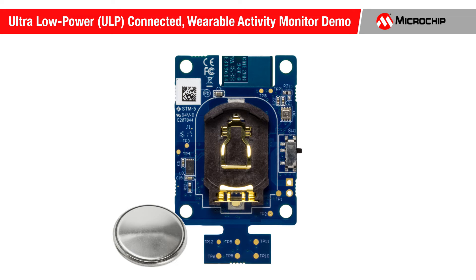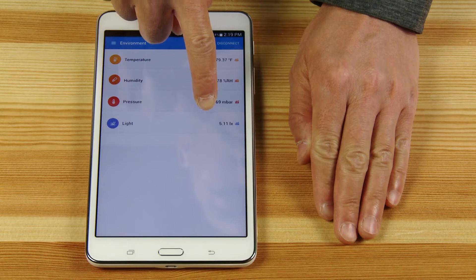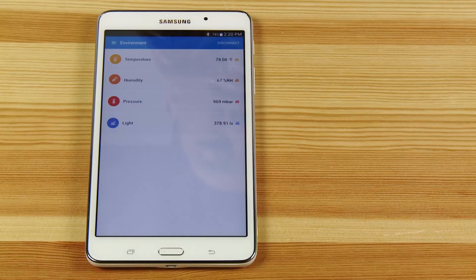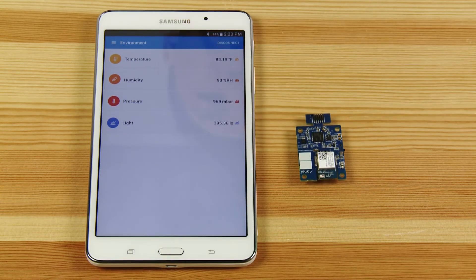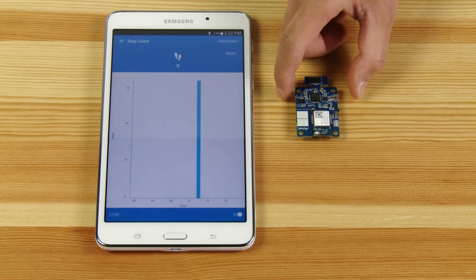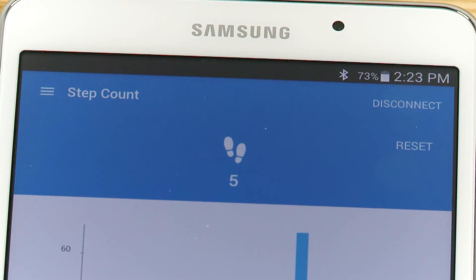Let's take a look at some of the features of the ULP connected wearable activity monitor demo. First, I will show the effect that covering the demo has on the ambient light measurement. Next, I will show the effect of breathing on the temperature and humidity measurement. These values can give valuable insight into a remote patient's environment. This demo also uses an accelerometer to measure step count and can be used to compute distance traveled.